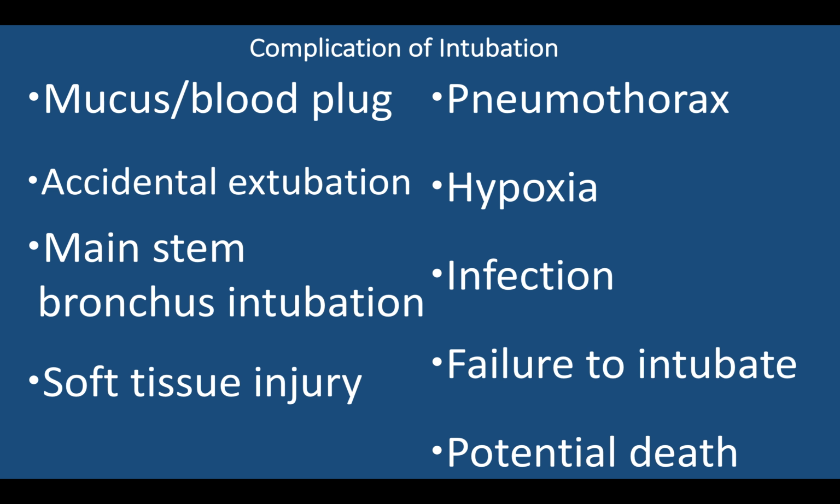Failure to intubate. We are not all skilled at being able to place endotracheal tubes. I find it extremely helpful to always have 2 skilled technicians at the bedside when intubating a patient. If that means that you and your attending, or your attending and an anesthesiologist are at the bedside, so be it.